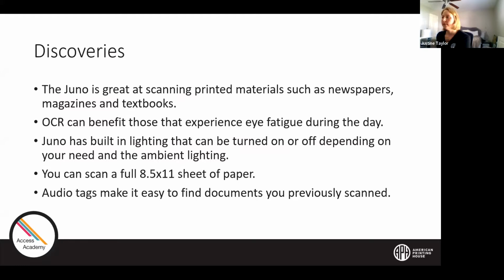For the last question, would a basic magnifier mode and advanced mode make Juno easier to use? 59% said yes, this would help. 11% said no, I wouldn't use it, and 30% said I'm not sure. So thanks for answering that poll question. This is something we've been discussing for a potential update to the Juno. The Mac Connect and other devices do have beginner or advanced modes that segregate certain skills on the device. So this is really good to know as we're looking at what the future of Juno holds.